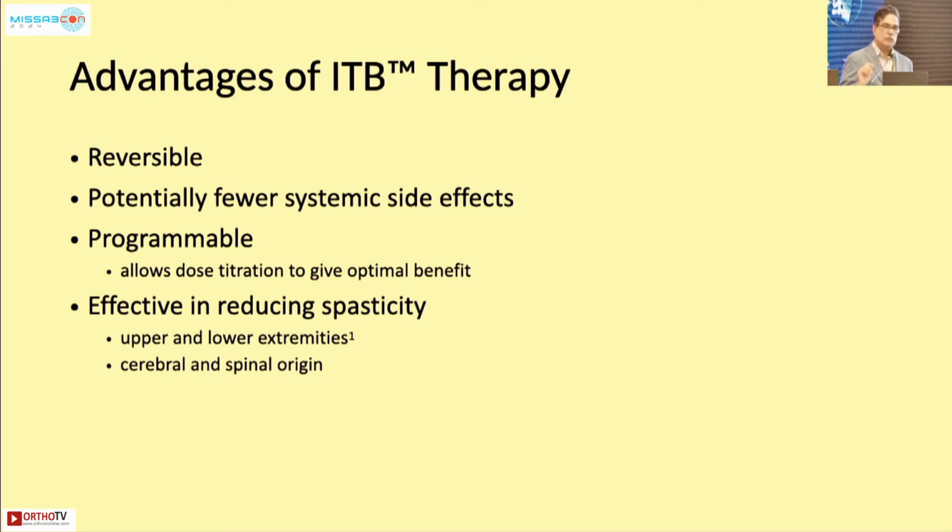It is also programmable if we choose the Medtronic pump. It is effective in both upper limb and lower limb spasticity, cerebral and spinal origin. Yes, it can be done in post-stroke spasticity as well, and it does not reduce the tone in the normal side.